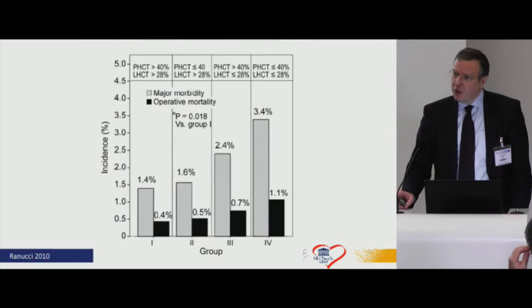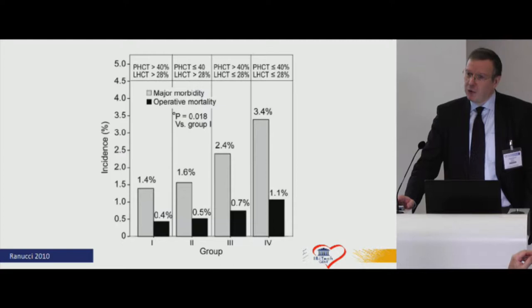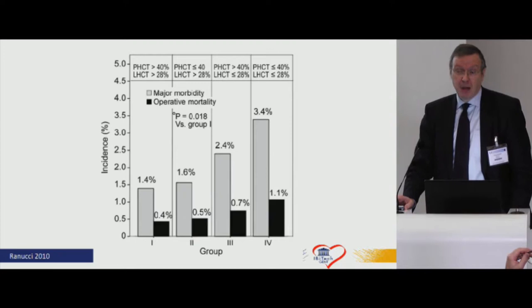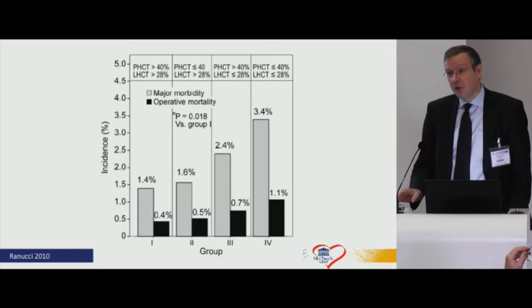So if we look in these non-transfused patients, then you can see there are two important factors. One of them would be the initial hematocrit. If they have a high initial hematocrit, then most likely hemodilution will be relatively acceptable. But the moment that the hematocrit is going down, like in this case below 40, and then the nadir hematocrit during bypass, of course, also will be lower, in this case below 28, you can see there is an increase in those patients of morbidity and even mortality. So we have to be careful on how we look at hemodilution.